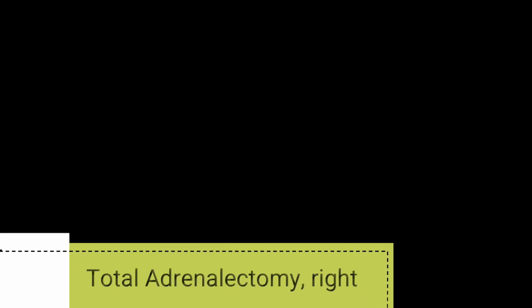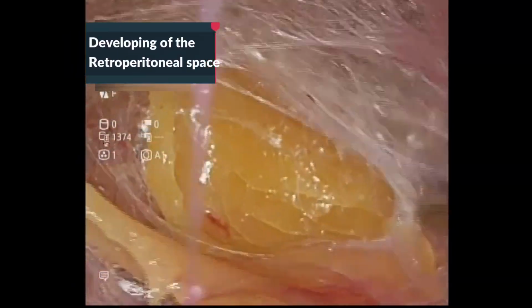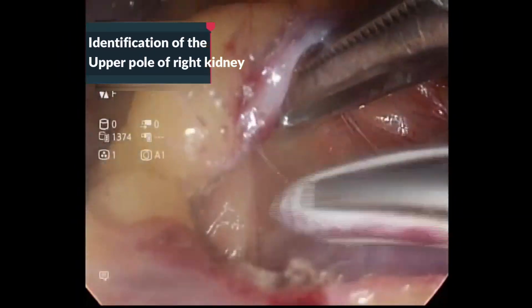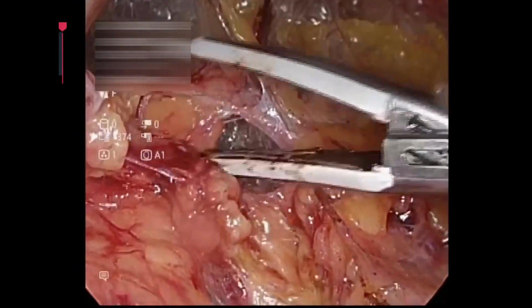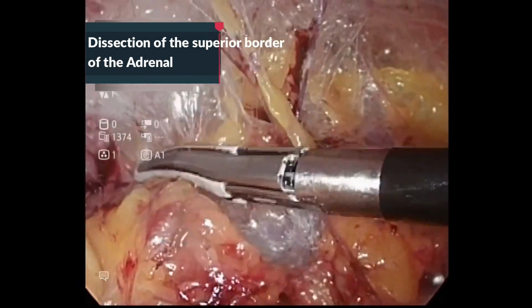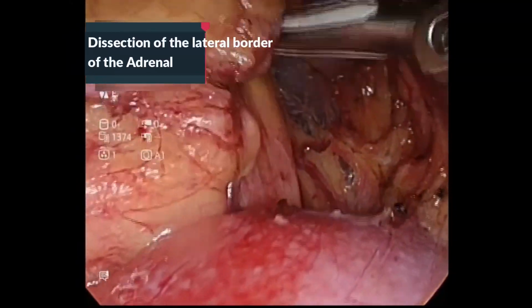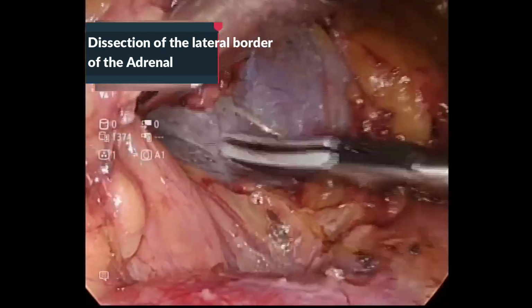Total adrenalectomy, right. The retroperitoneal space is developed using blunt dissection, which is followed by the identification of the anatomical landmark, which is the upper pole of the right kidney, followed by the dissection of the lateral border and medial border.